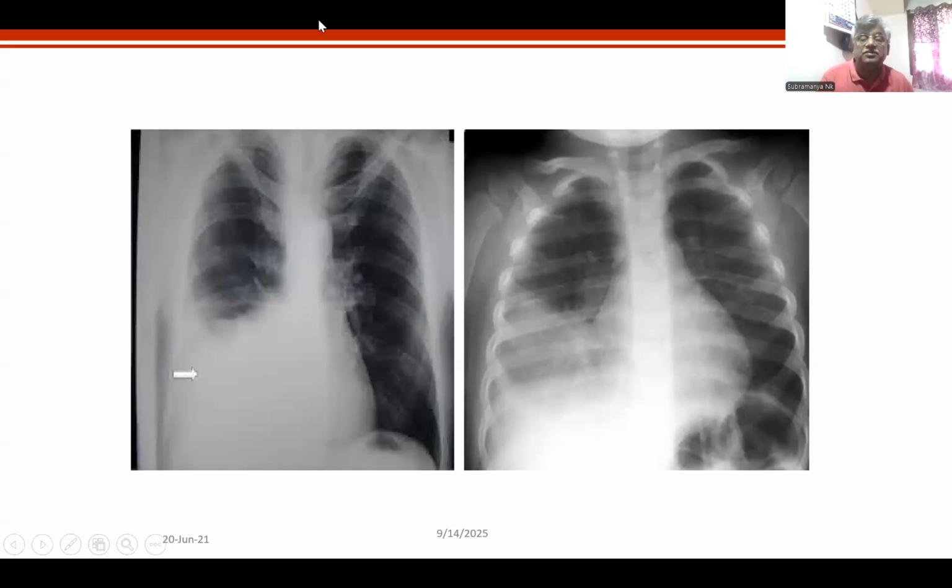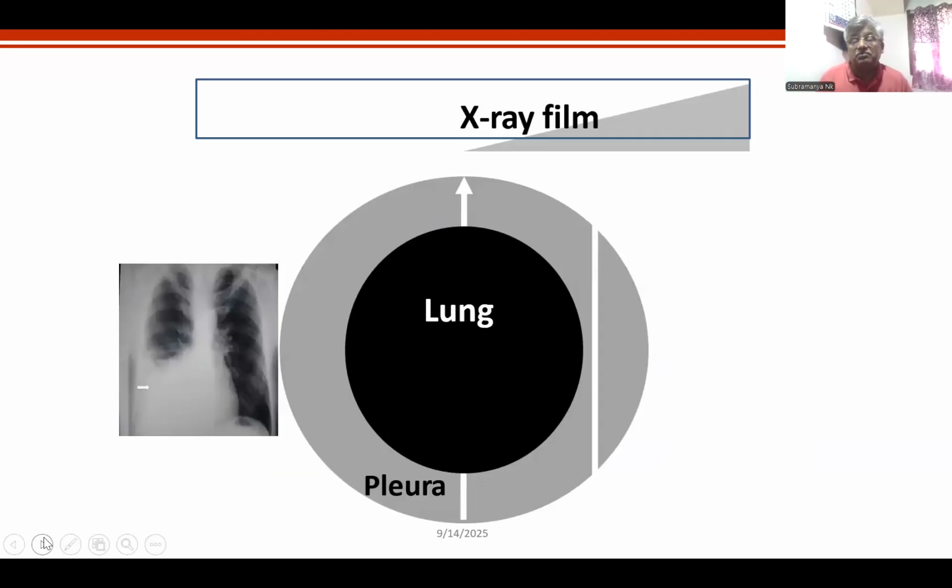Now, the point which I was trying to tell you is that don't stop interpreting an X-ray. Completely interpret. Now, I will give you the next example, for which all of you should give me coffee whenever we visit in future conferences for this concept.